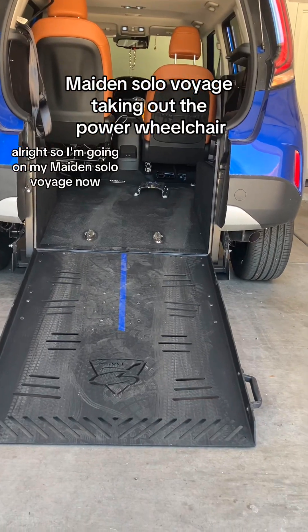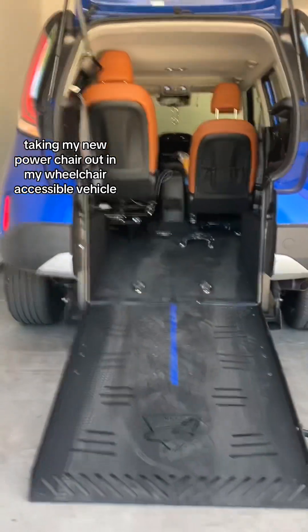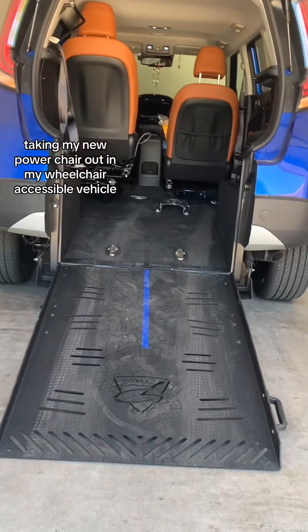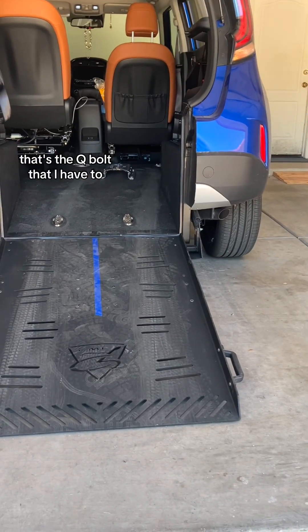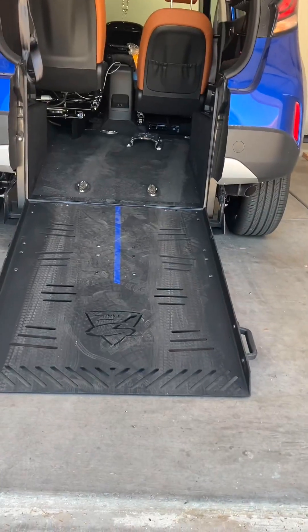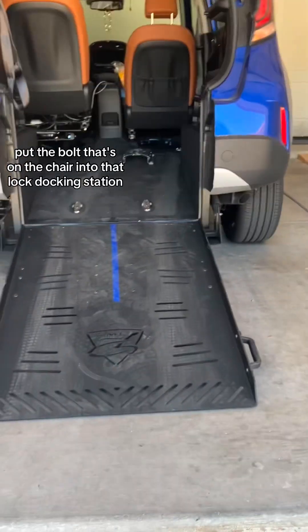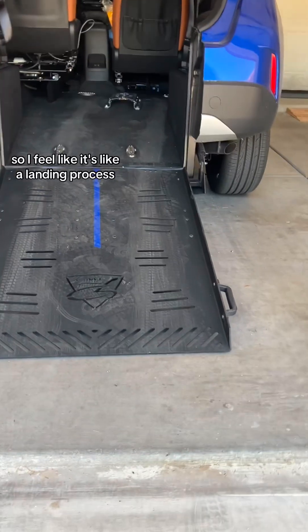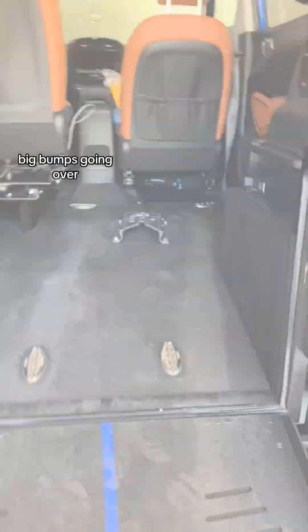I'm going on my maiden solo voyage, taking my new power chair out in my wheelchair accessible vehicle. That docking station right there is the Q-bolt — I have to put the bolt that's on the chair into that locking docking station. It feels like a landing process; I gotta line myself up just right. Big bumps going over.